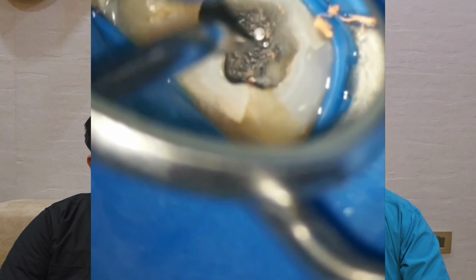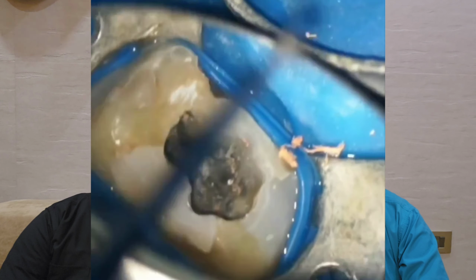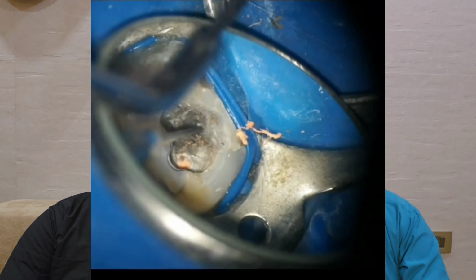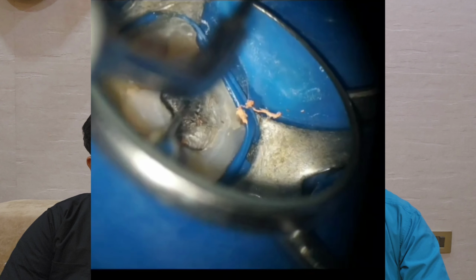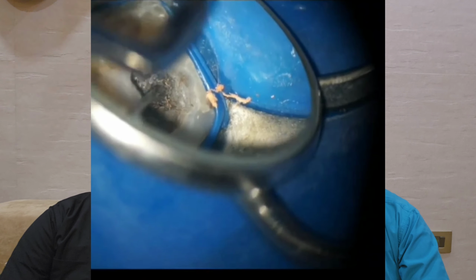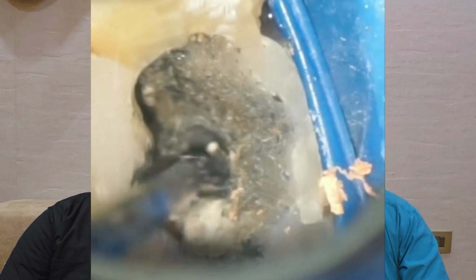You cannot just send the patient away with that in the mouth. You can either remove it, like we will show you in the video how we remove it. We use the microscope and special tools to remove these broken instruments, or you have to bypass it and clean everything around it. And it is a manageable complication.